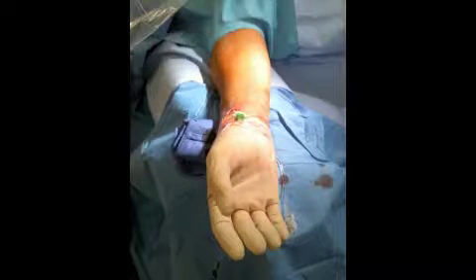Now, prior to talking about the radial access point, I would like to have everybody find their pulse first. This is what the physician is going to be looking for to be able to place the sheath. Take your wrist and right by the thumb, put your two fingers and feel for the pulse. This is where the sheath is going to go that the physician is going to be able to obtain access into the body. Now that everybody has found their pulse, this is what the radial access point would look like.